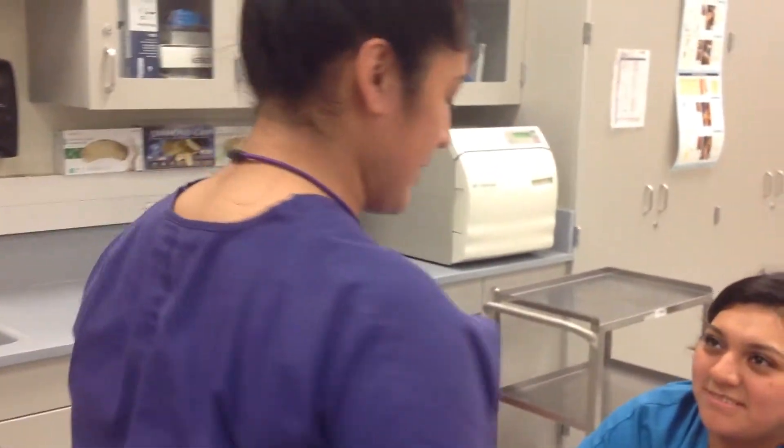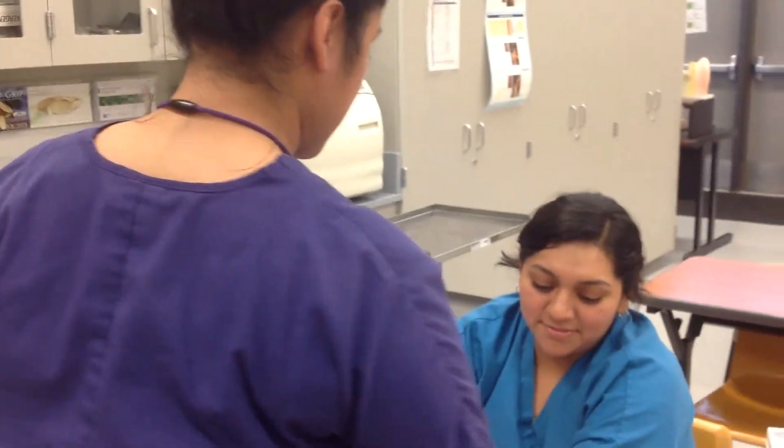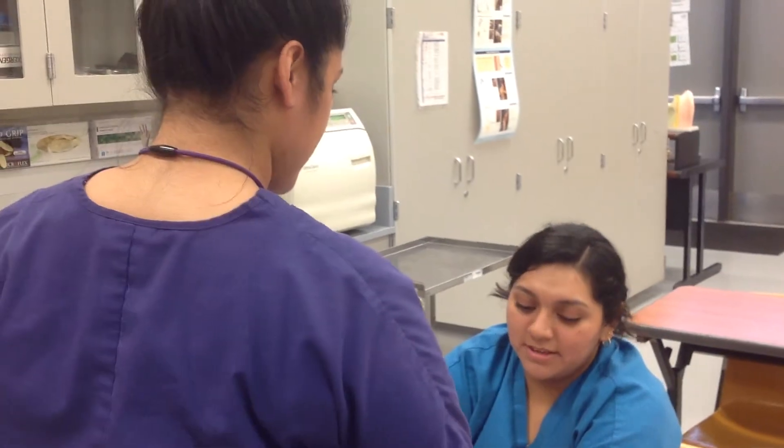Hi, I'm Betsy. I'll be your medical assistant today. We're going to be doing a TB test. Which hand would you prefer? The other hand.